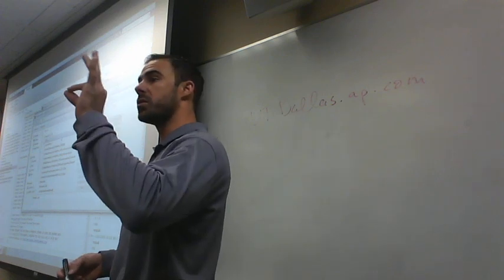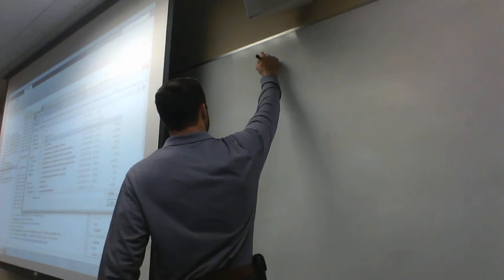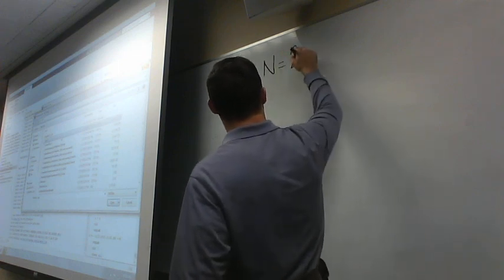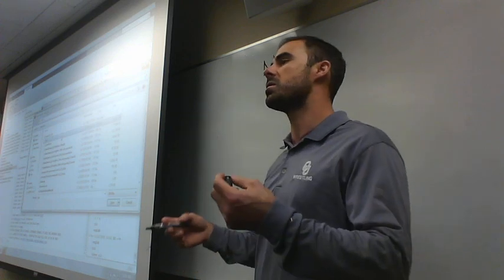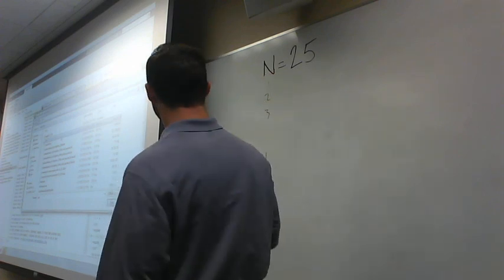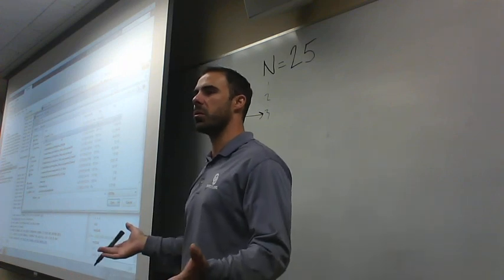Okay, so what does number 3 refer to? When we're recording or running these experiments, we have a sample size that we're going to use. The big letter N means sample size. We're going to have 25 people in our experiment. We call them subjects or participants. You number them 1, 2, 3, down to 25. We always start by naming the file by which subject it was. In this case, we happen to be using participant number 3.